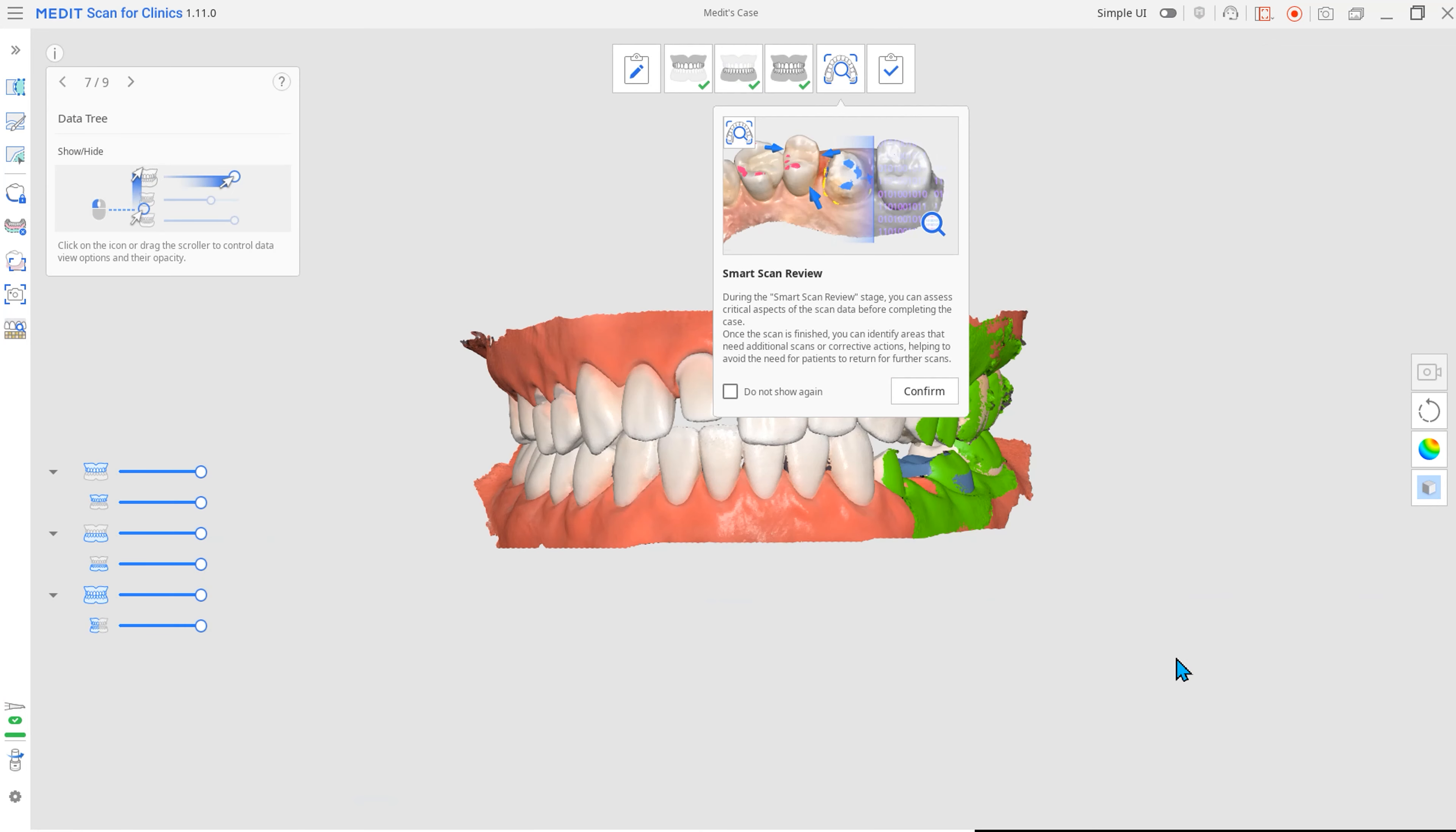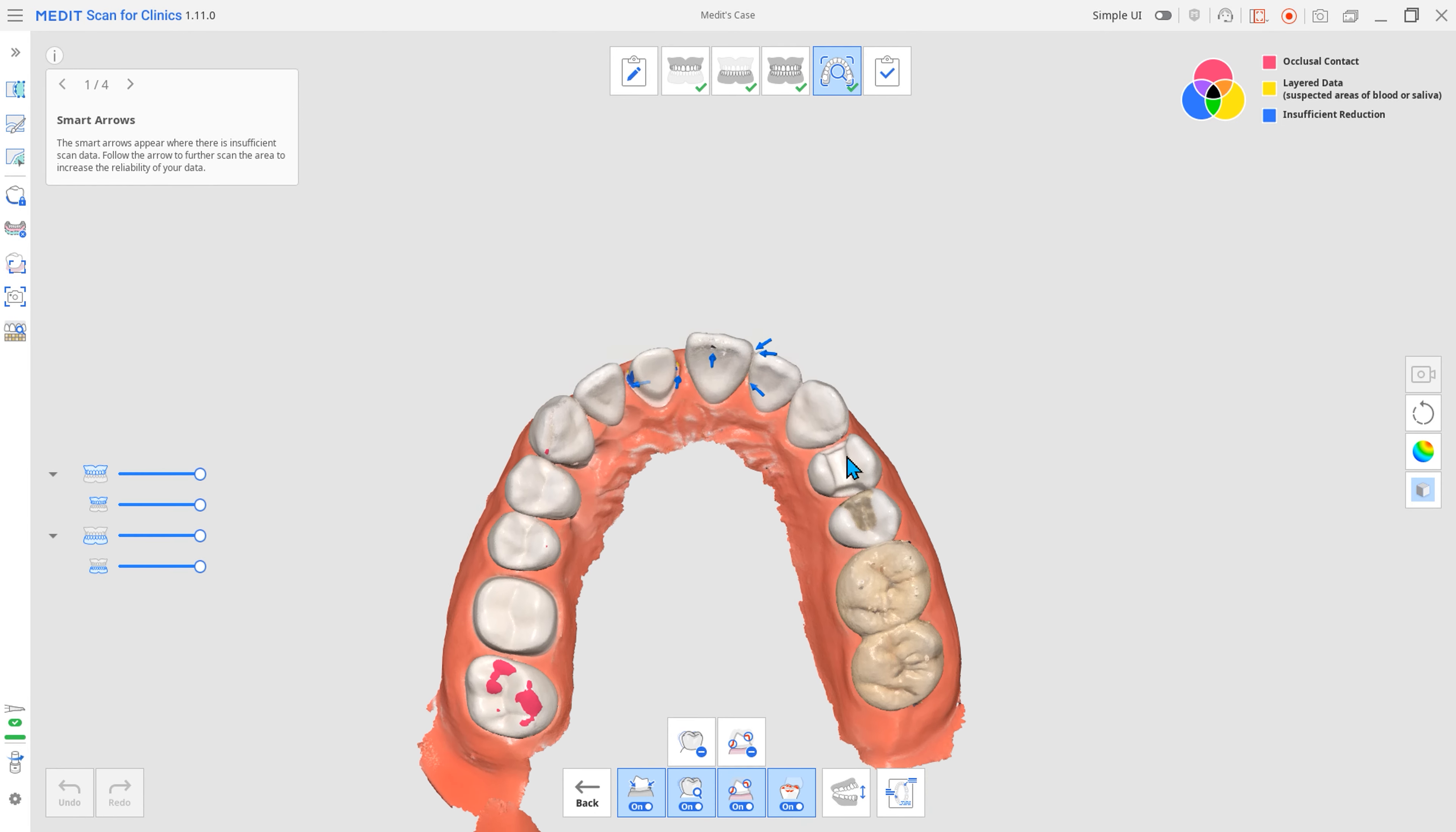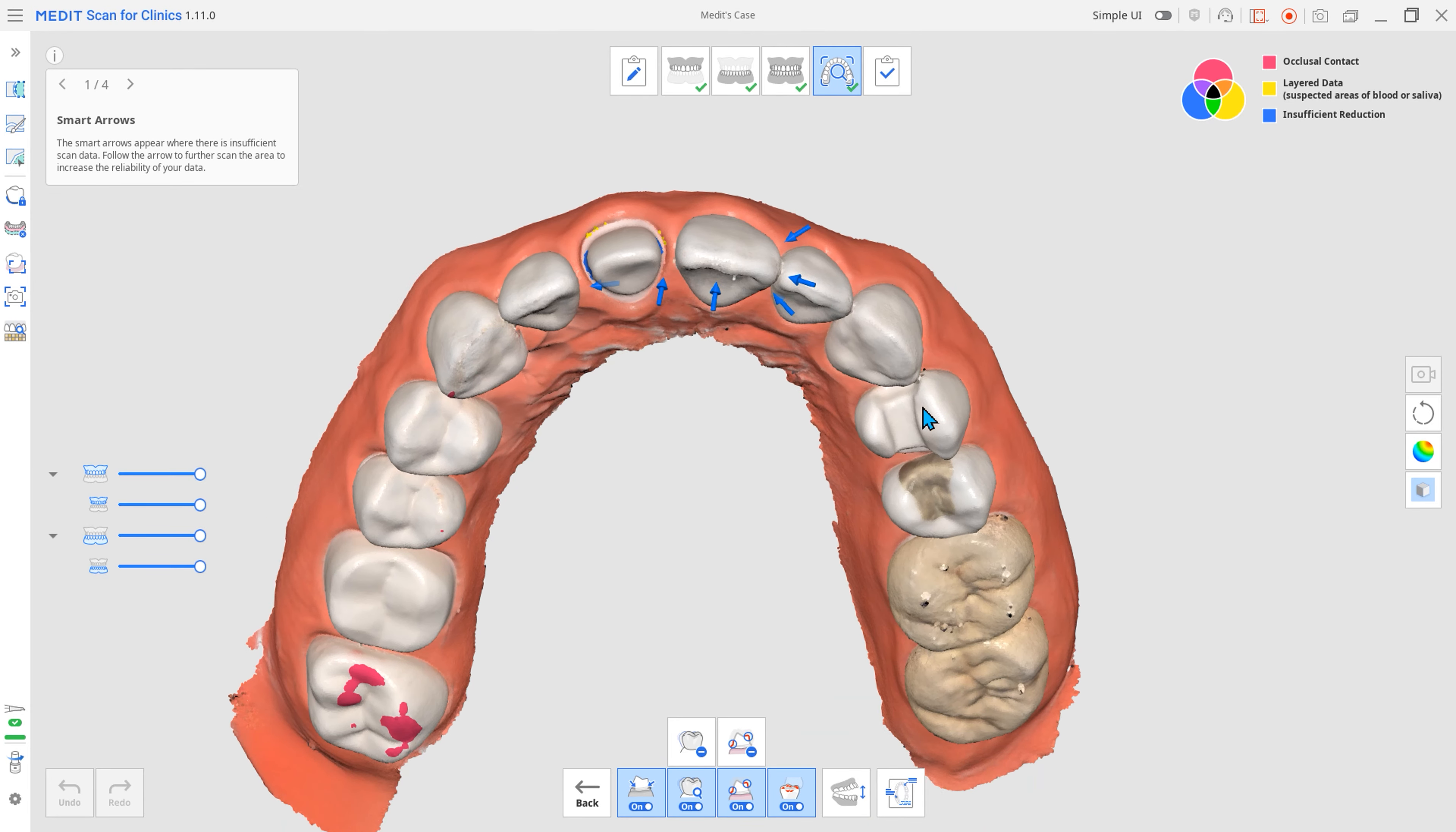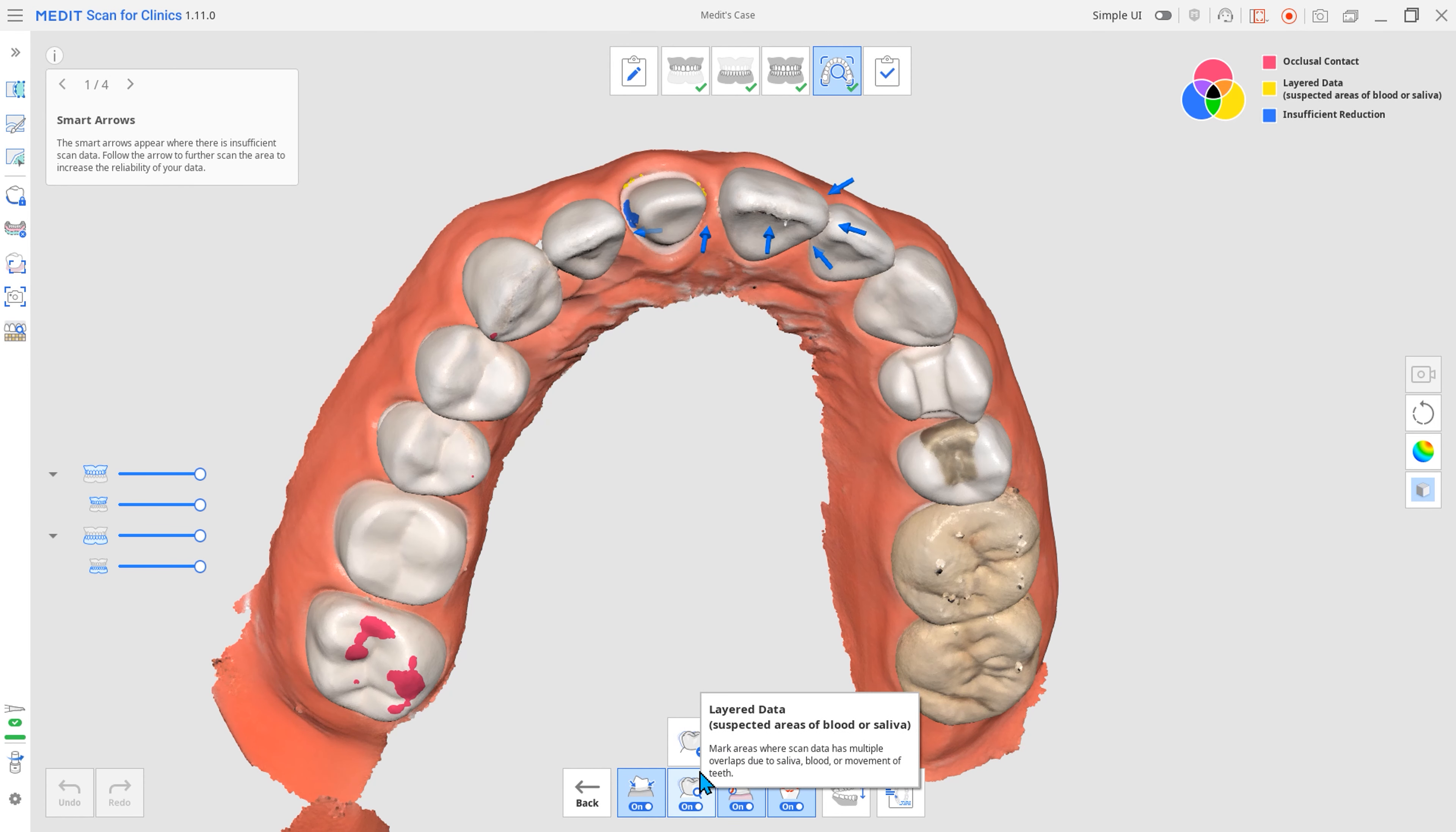Next is Smart Scan Review. This new stage assesses areas requiring further scans or actions in real-time and minimizes the need for patients to return for additional scans. After identifying areas of prepared teeth and their adjacent teeth, you can check the Smart Scan Review report for insufficient data acquisition.